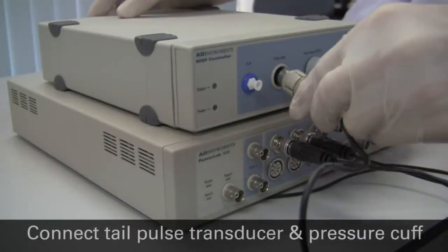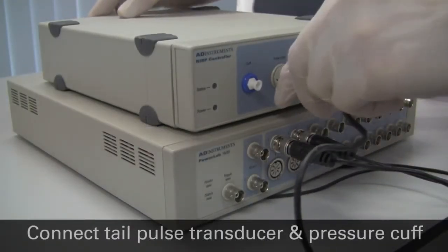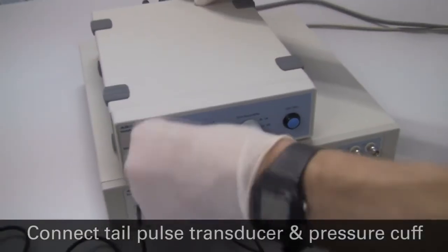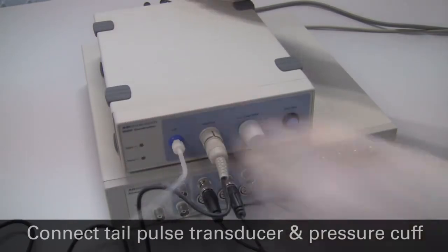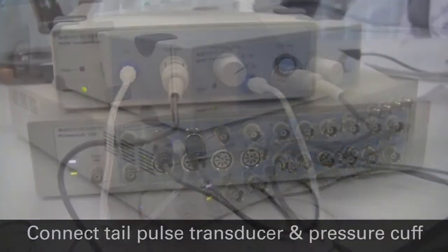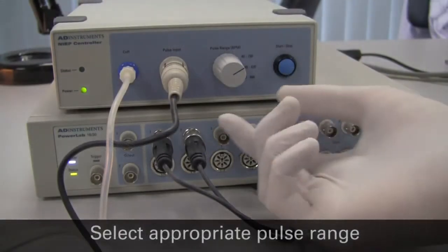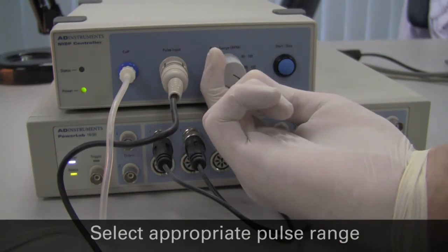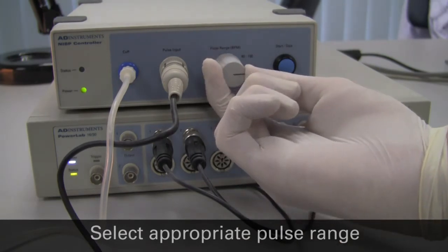Connect the pulse transducer to the pulse input connector on the front of the NIBP controller, and connect the pressure cuff to the cuff connection. Select the appropriate pulse range on the front of the NIBP controller. The maximum cuff inflation pressure can also be selected on the rear panel.